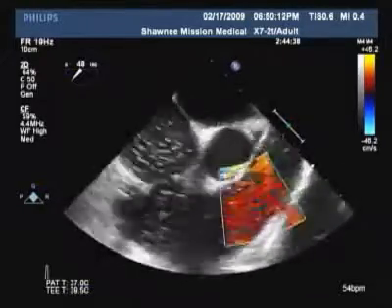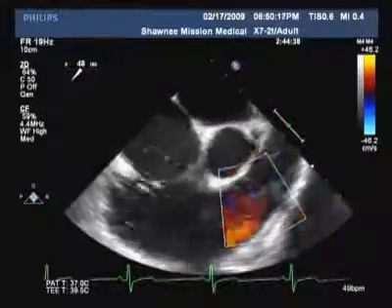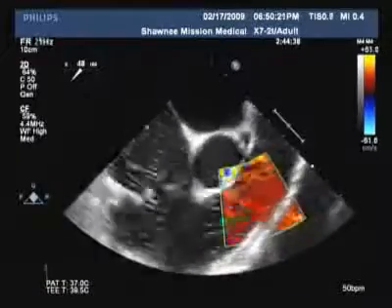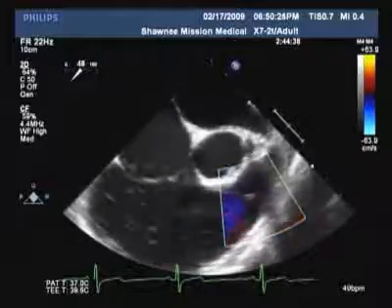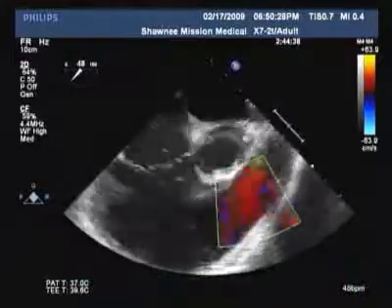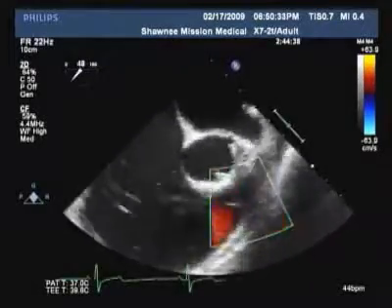Typically, a lot of younger patients have some pulmonic valve insufficiency down here, but we don't really see a lot. The bubbles obscure our view a little bit with this right now, but really don't see a lot. Looks like the pulmonary artery is good, the pulmonary outflow tract. I would agree. It does not look dilated or enlarged at all. I think that's a great point again. We're really not finding too much other than an abnormal valve, are we? I think that's exactly right.